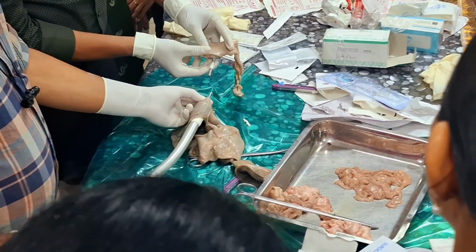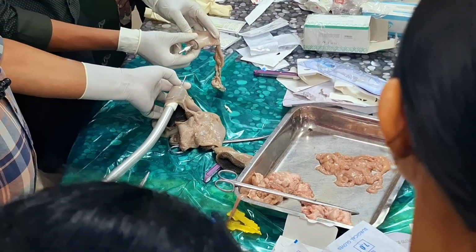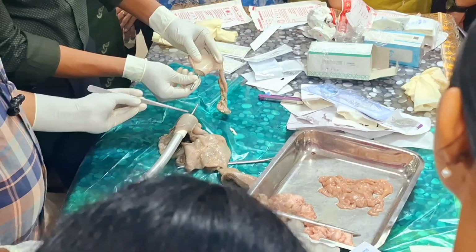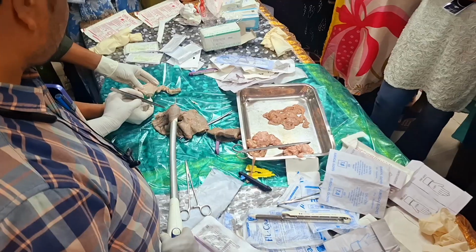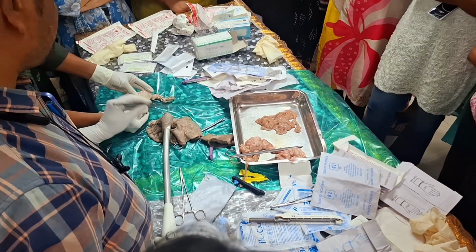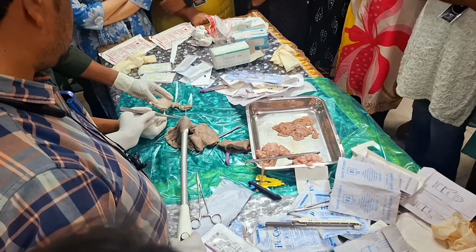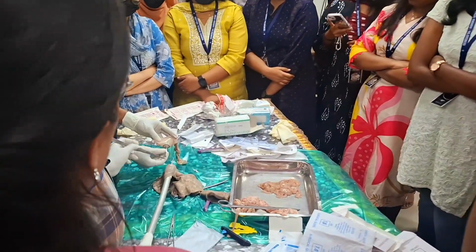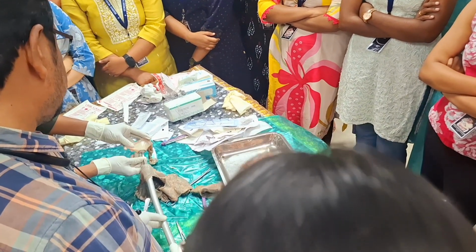The important thing in an end-to-end stapler, whether you do it open or laparoscopically, is always try to see this in it. It is usually in orange color. Otherwise the engagement will not be proper. Only when this ring is seen, then you engage that, and you will hear a click sound.